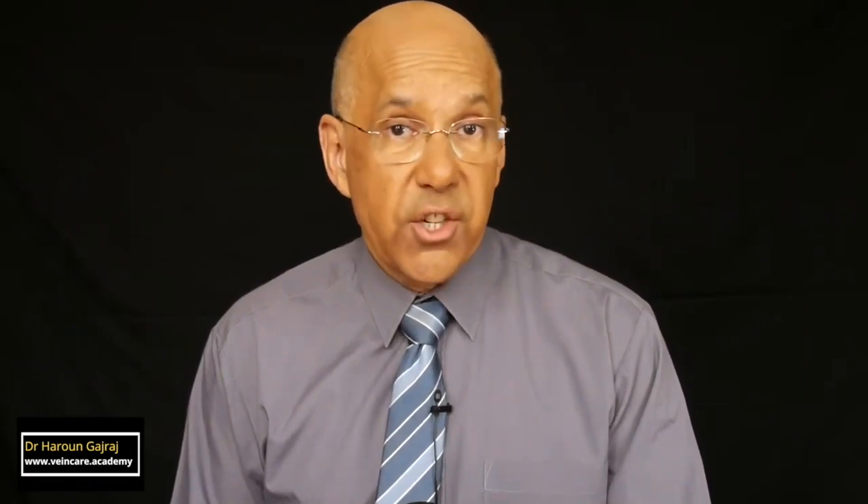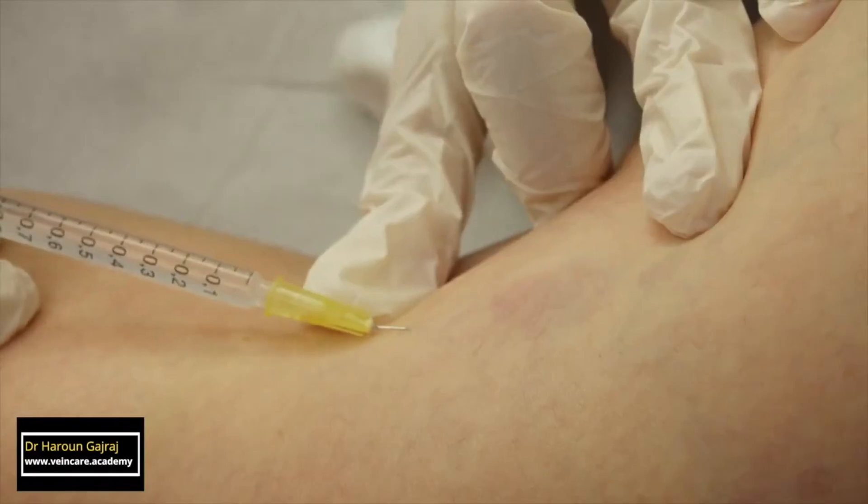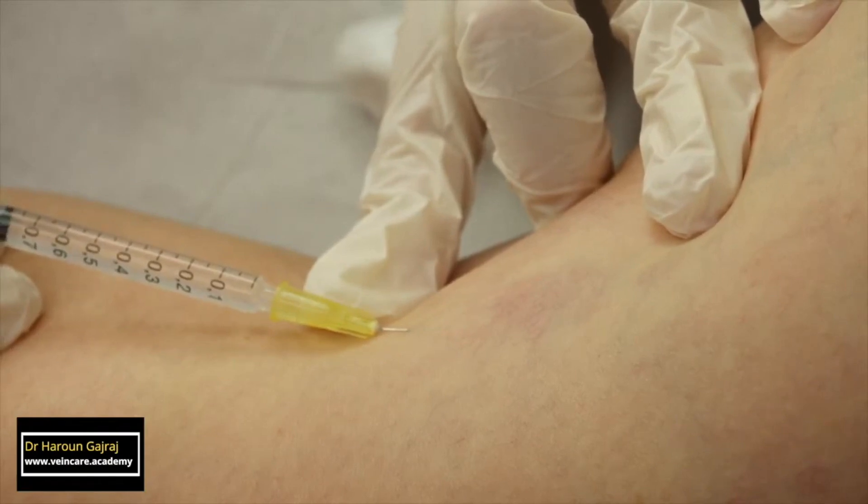Let's turn to the injection of reticular veins and blue veins. Reticular veins lie just deep to the skin at the junction of the dermis. So when you are injecting blue veins, the needle is not flat on the skin. Instead, it is angled by 5 to 10 degrees.